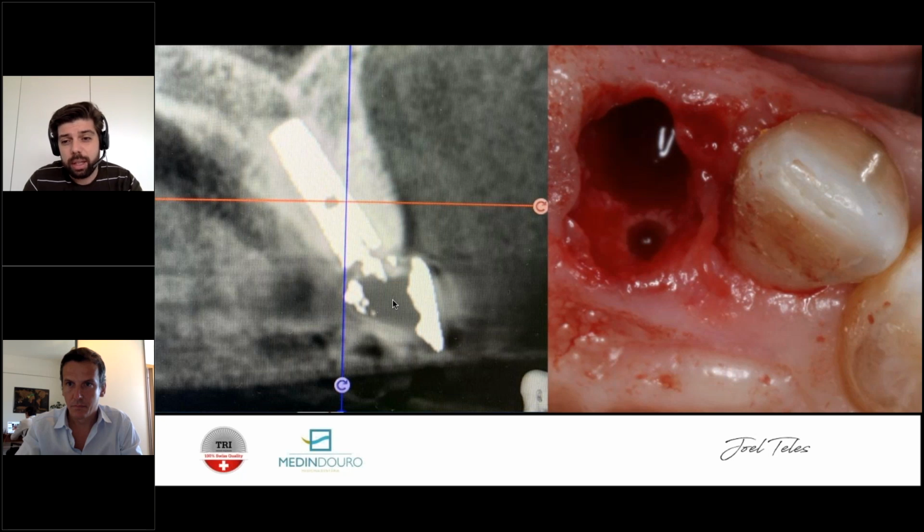The quick answer that everybody will give you is 3 millimeters below the tissue line. Well, it's not always like this. It depends on many factors. Sometimes I'll go a little bit deeper, and sometimes I'll go 2 millimeters, 1.5. And it has to do exactly with what I'm aiming for with the tissue. Up to a certain point. The border for me is approximately 2 millimeters. So if the defect is more than that, I will not risk it. But if it is between 1 and something millimeters, I will try to reset biology to work in my favor. I will give it a try.